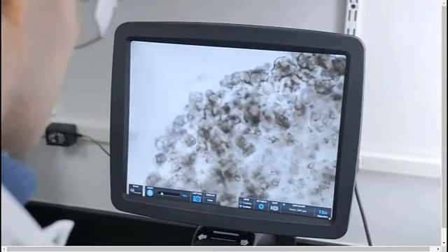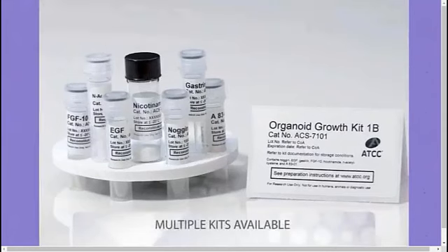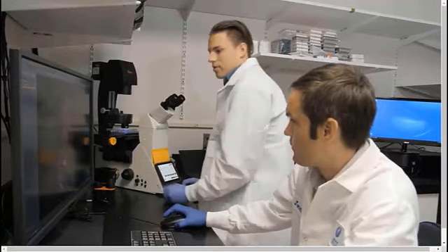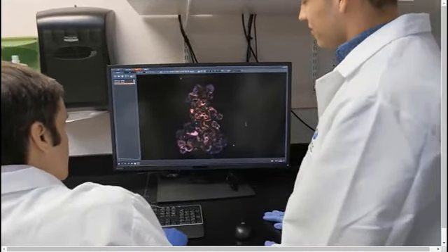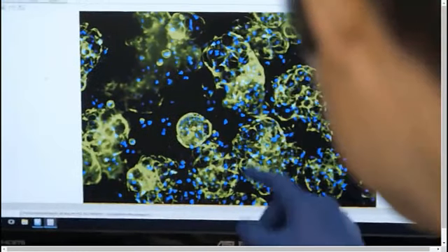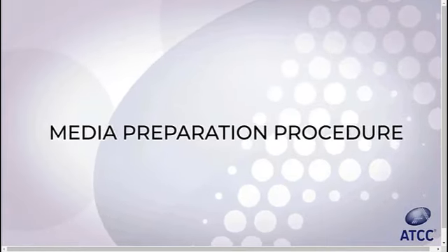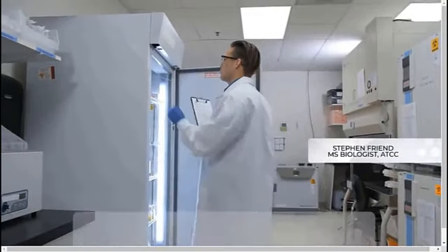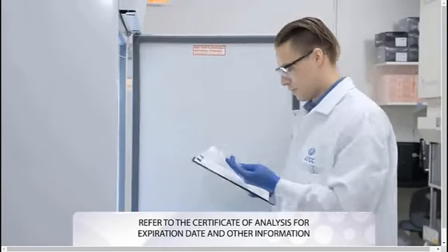This video is intended to help tackle how to prepare organoid culture media utilizing prepackaged kits made by ATCC. These kits, when combined with other reagents, are designed to facilitate the creation of a complete growth formulation for various primary tissue-derived organoids, including those developed from the Human Cancer Models Initiative. Kits should be stored in a non-frost-free freezer at -20°C or below prior to use.